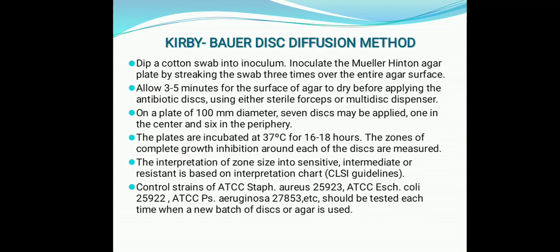The control strains we can use are ATCC Staphylococcus aureus 25923, ATCC Escherichia coli 25922, ATCC Pseudomonas aeruginosa 27853, and some other strains as well.